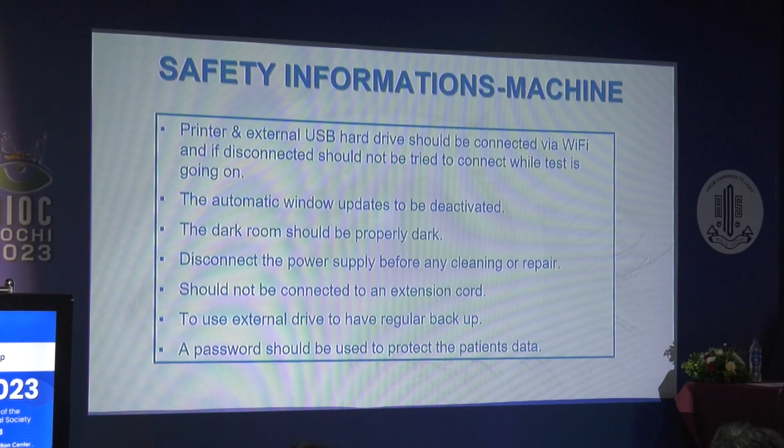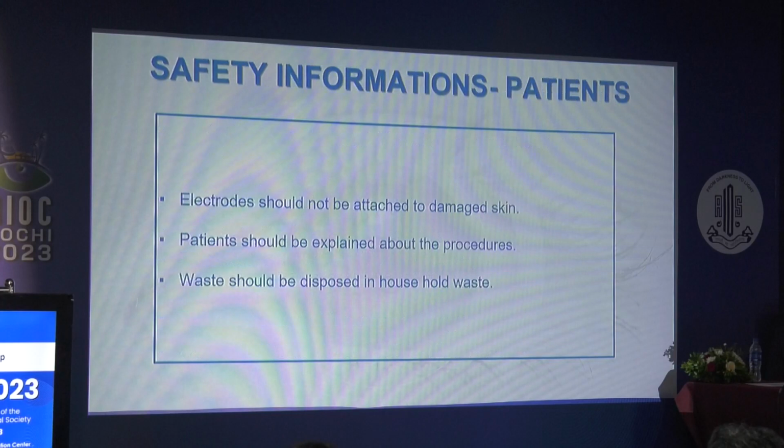Safety information, both for the machine and for the patients involved. First, for the machine, the printer and an external USB hard drive should be connected via Wi-Fi, and if disconnected, should never be tried to connect while doing the test. The automatic windows updates should be deactivated. The dark room should be properly dark. Disconnect the power supply before any cleaning or repair. It should not be connected via an extension cord. Always use an external drive to have a regular backup. A password does help to protect the patient's data.